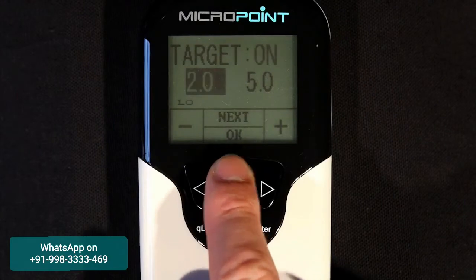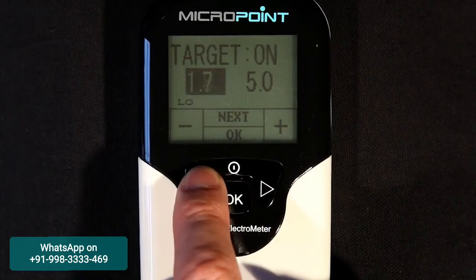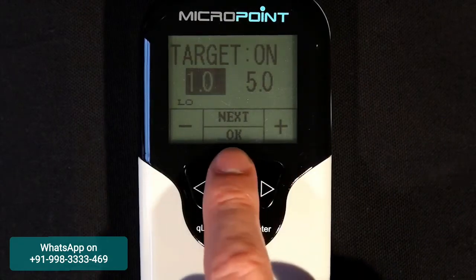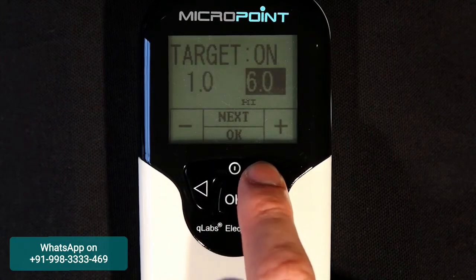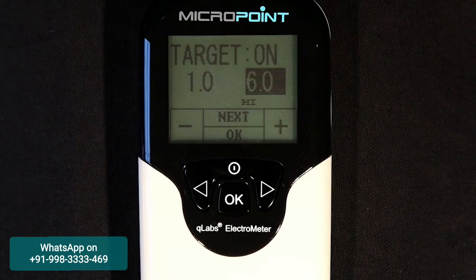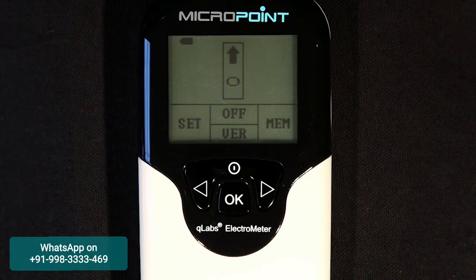Press the next button to highlight the next field and change the lower INR limit to the desired settings. Press the next button again to highlight the next field and change the higher INR limit to the desired settings. When all settings are acceptable, press the OK button to confirm settings.